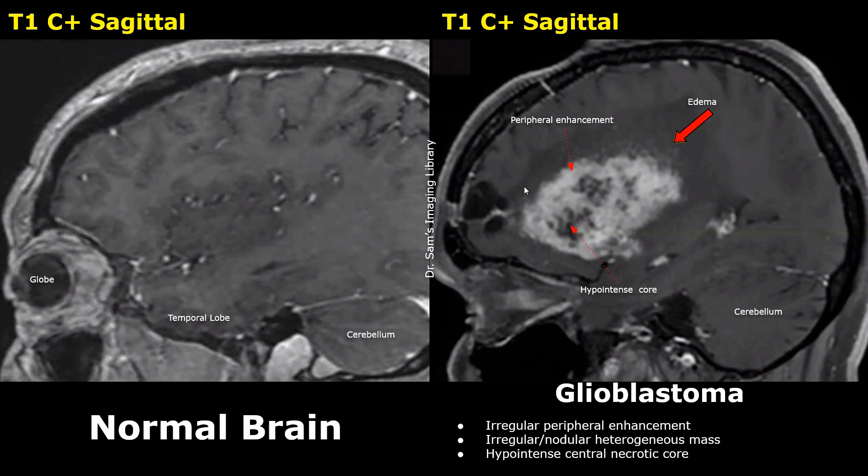T1 contrast-enhanced images are very helpful in the diagnosis of glioblastomas, but it becomes more accurate when multiple sequences are studied, especially T2 and FLAIR sequences. We will study them separately. Thank you so much for watching. Stay tuned for more imaging videos.